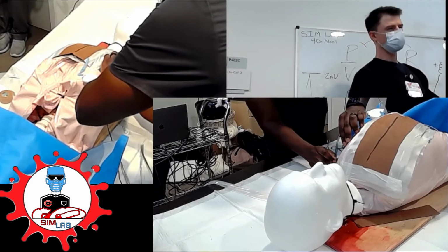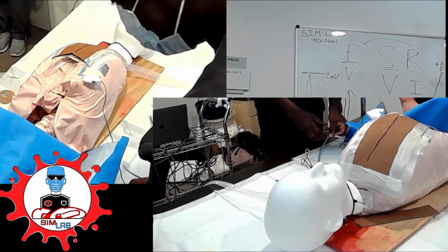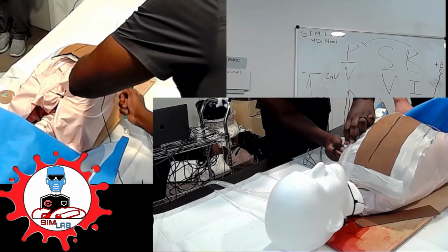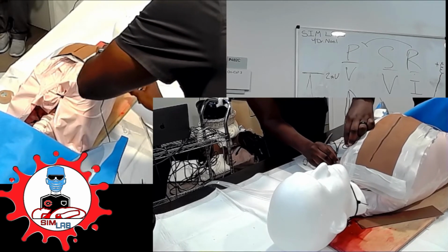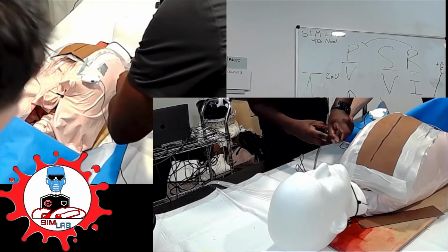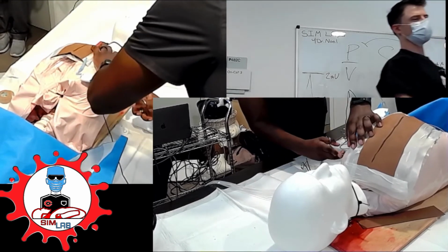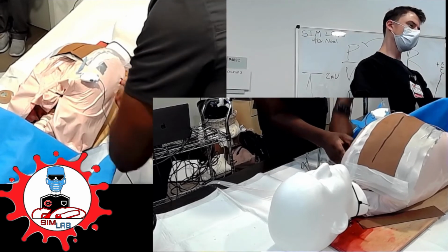You may want to clamp the end so you don't get blood all over your feet. Let it go, that's the beauty of the sim lab. Everybody leaves messy. Once you pop in, spread, come out, finger in.